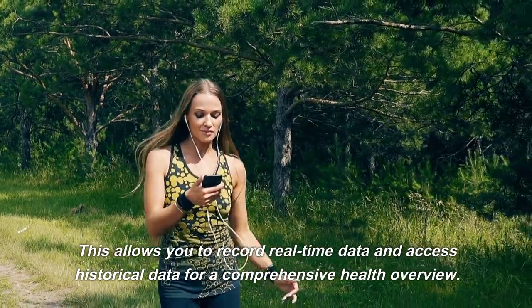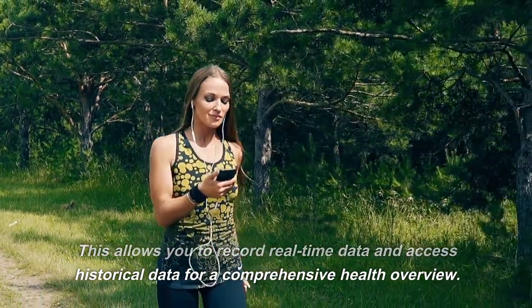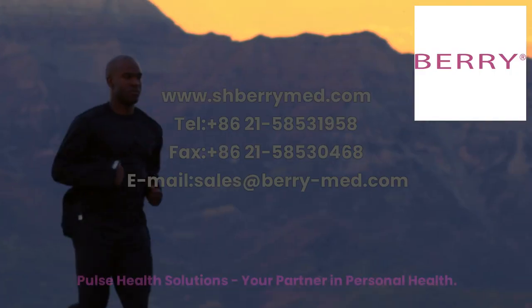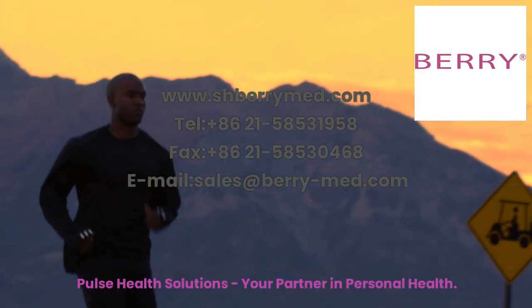This allows you to record real-time data and access historical data for a comprehensive health overview. Upgrade to the BM1000C fingertip pulse oximeter and take control of your health like never before. Pulse Health Solutions — your partner in personal health.